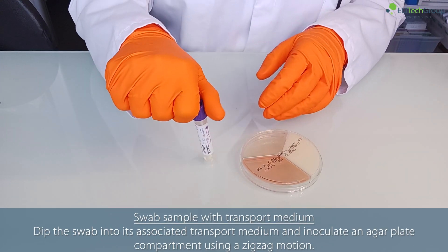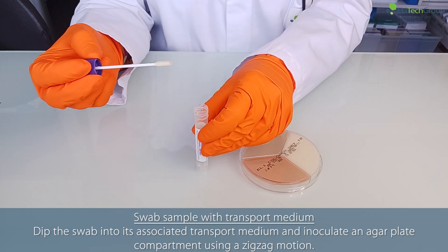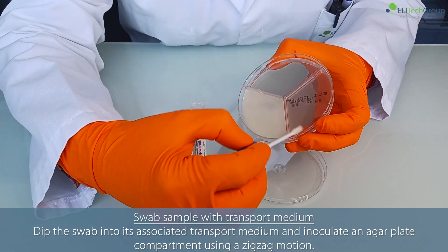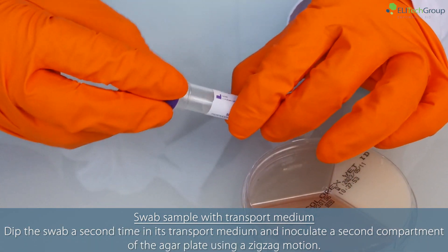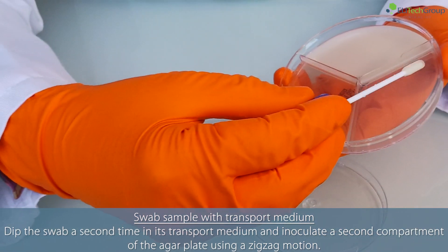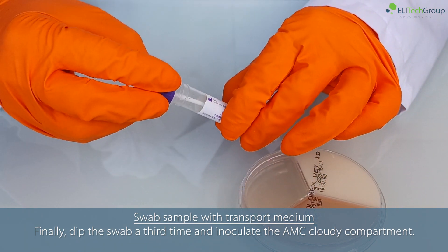For swab sample with transport medium, dip the swab into its associated transport medium and inoculate an agar plate compartment using a zigzag motion. Dip the swab a second time and inoculate a second compartment using a zigzag motion. Finally, dip the swab a third time and inoculate the AMC cloudy compartment.